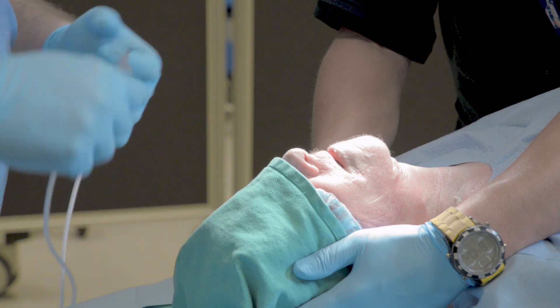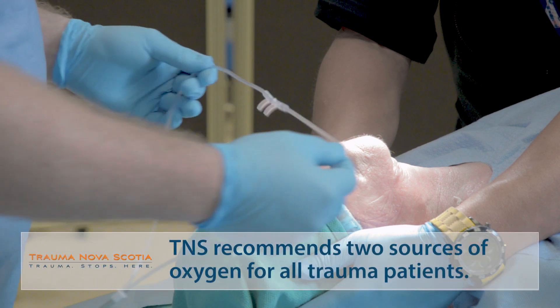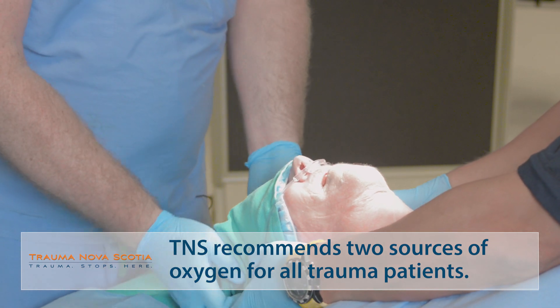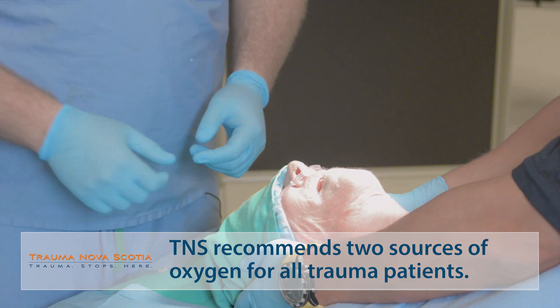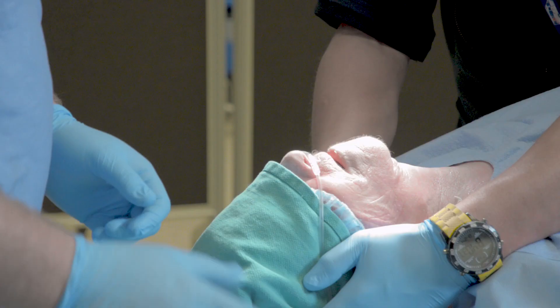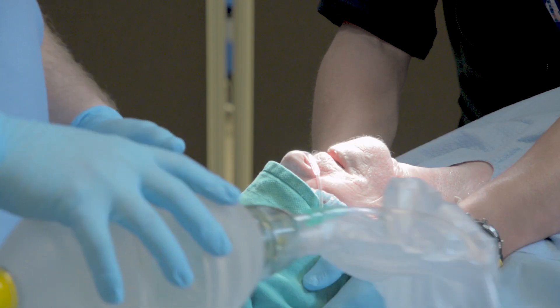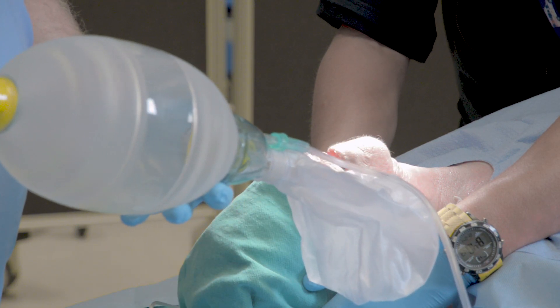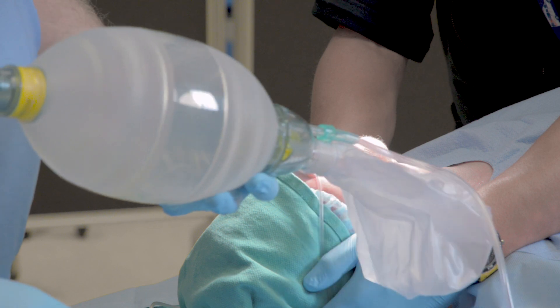The first source of oxygen is high-flow nasal prongs placed on the patient and attached to an oxygen source of at least 15 liters per minute at the wall or a secondary O2 tank. The second source of oxygen goes into the back of the bag mask ventilator, again at 15 liters per minute to the wall or a secondary O2 tank.